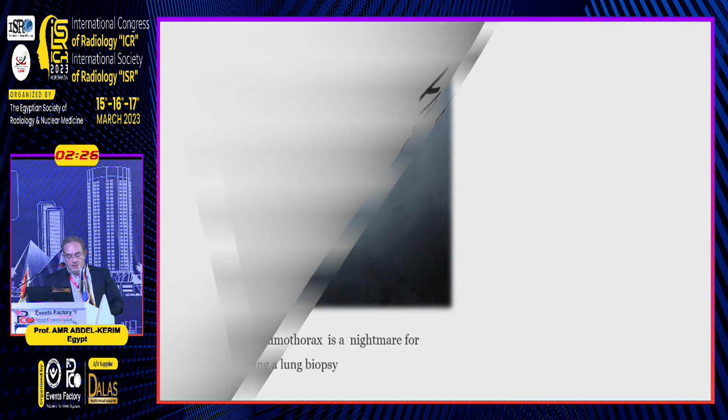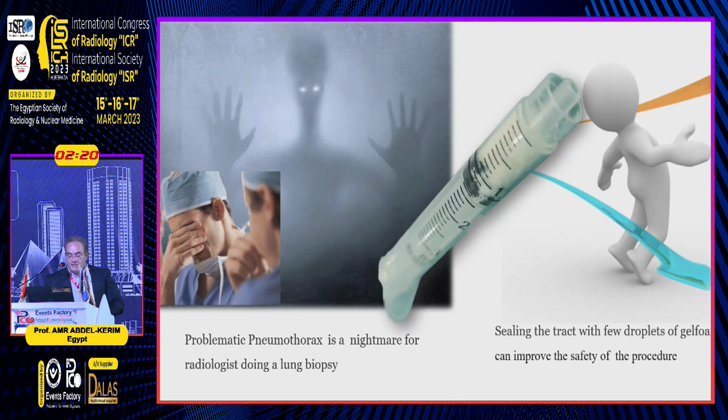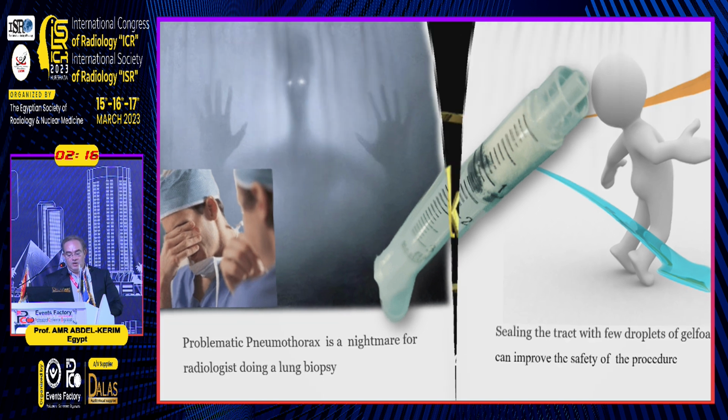Briefly, problematic pneumothorax is a nightmare for any radiologist doing a lung biopsy. Sealing the tract with a few droplets of gel foam slurry can improve the safety of the procedure.